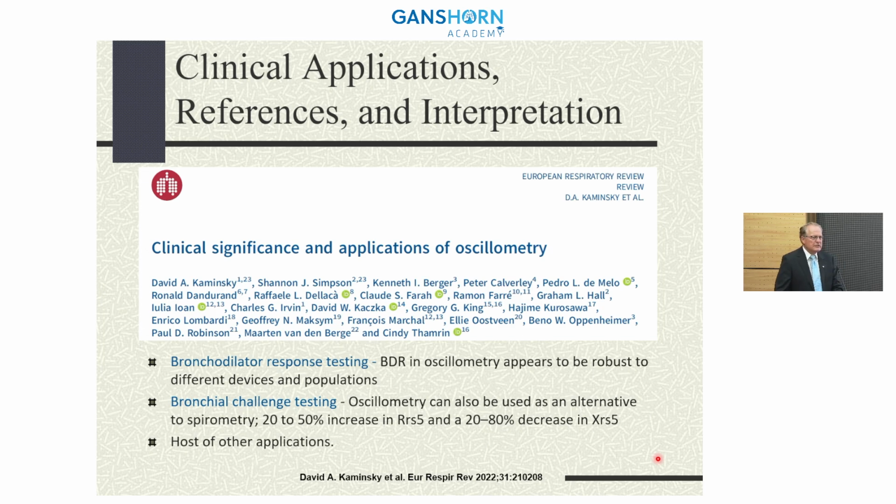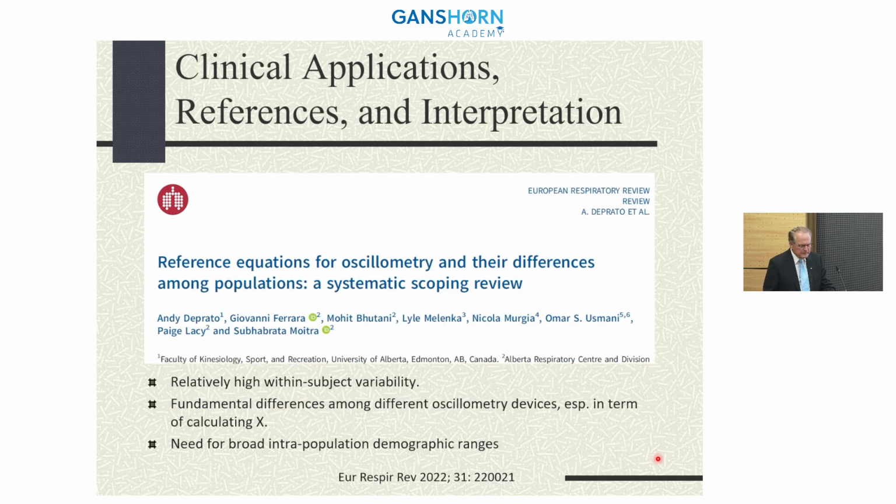but he also listed a long host of clinical applications for this device. And essentially, as a clinician, if you want to understand or characterize airway function in someone that is challenged by performing routine spirometry, oscillometry is a wonderful alternative. As far as reference populations, there needs to be more work done.